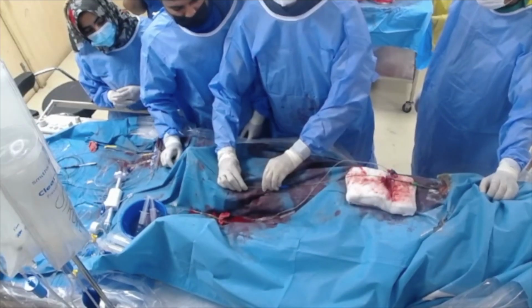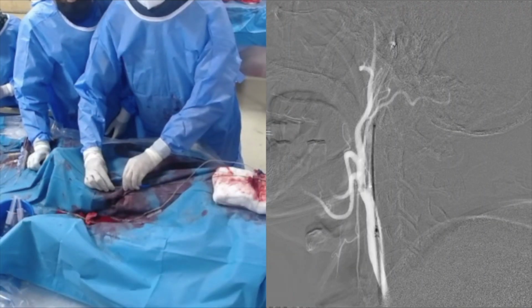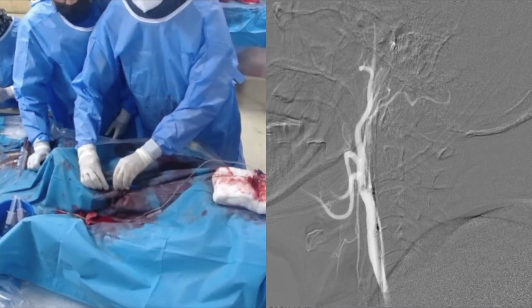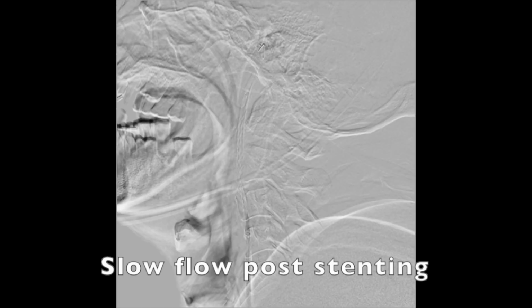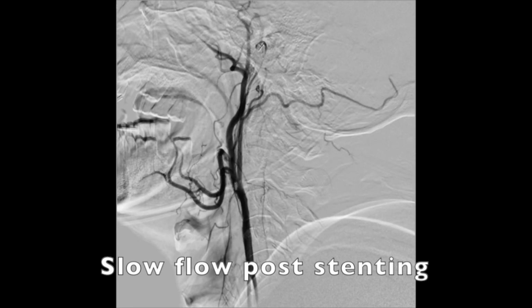With Casper, it's important to ensure that the double mesh layer covers the whole plaque or the whole affected area, as we did in this case. So I'd taken a slightly longer Casper for this case, which was 8 by 30 millimeters in dimension. And after deployment of the stent, we saw that there was flow, but there was still slow flow post stenting.